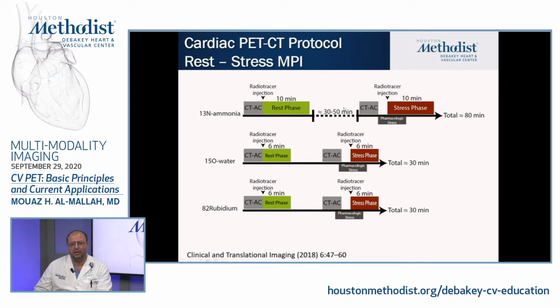The main difference with ammonia, if you don't have a digital PET and you cannot use the low dose, high dose protocol, then you have to wait 50 minutes in between.